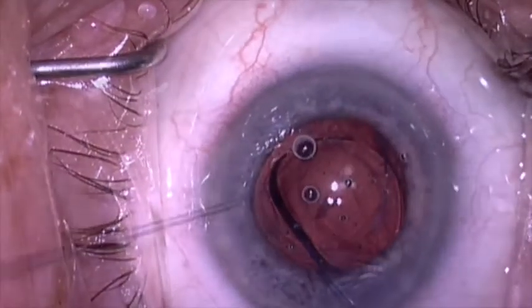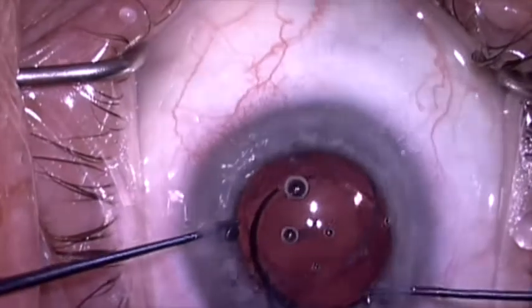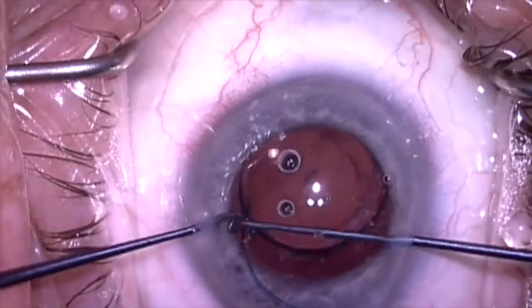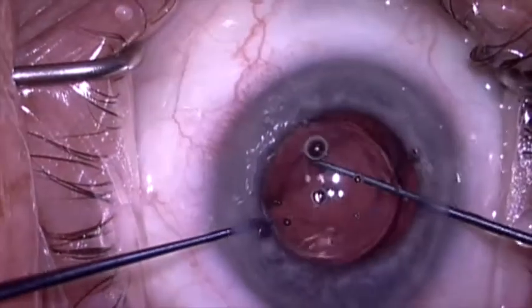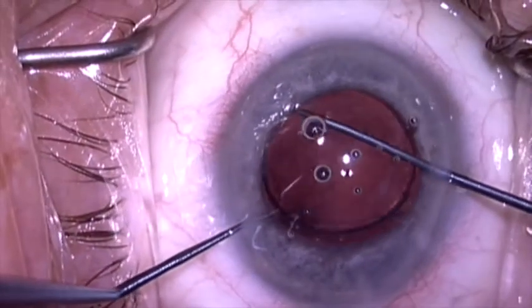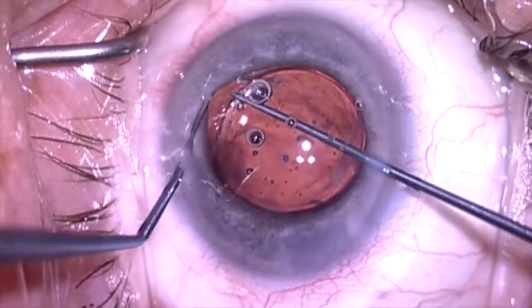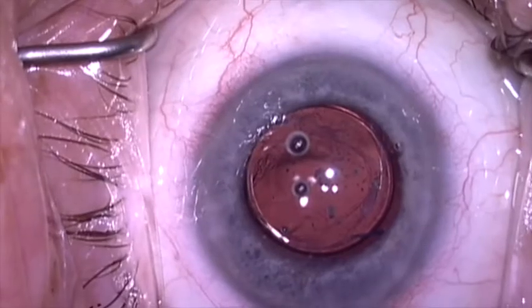Then I can dial it into the recess of the capsular bag without disturbing the posterior capsule opening, which is pretty large here. So now the lens is carefully rotated into the donut-shaped capsular bag remnant. I'll rotate it slightly to make sure that the haptics are in the equator of the capsular bag, and the case is completed. Thank you for your attention.